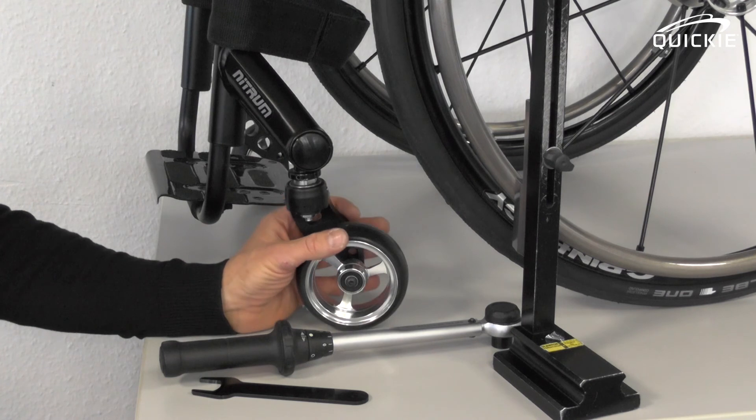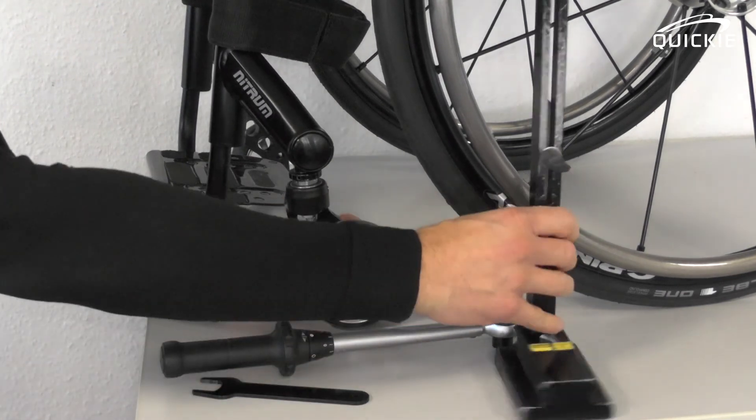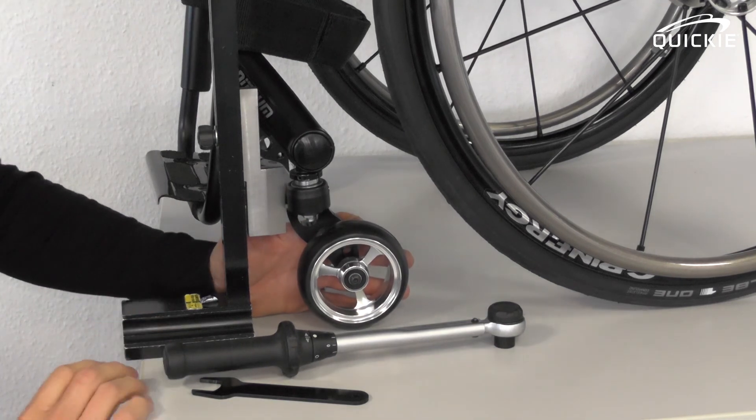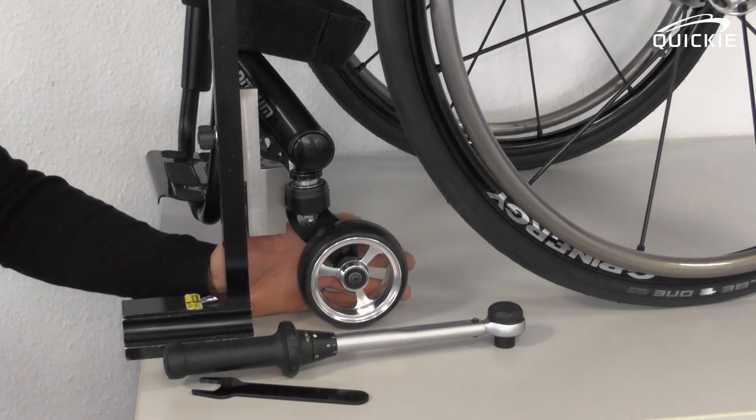After having done this procedure, you might want to check the caster fork angle again, because in many cases you need to readjust the caster fork angle as well. This procedure can be found in another video.